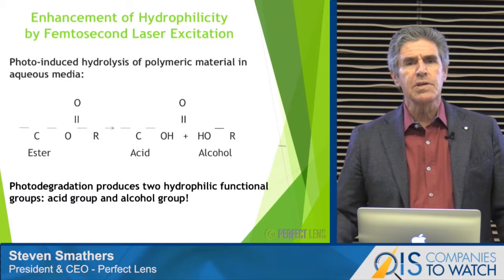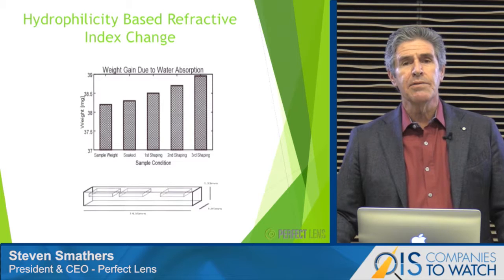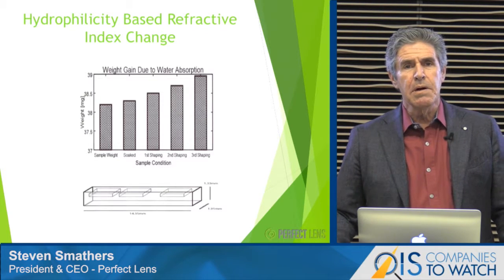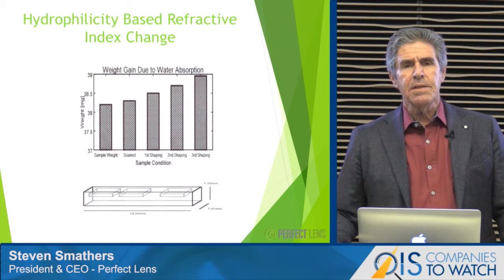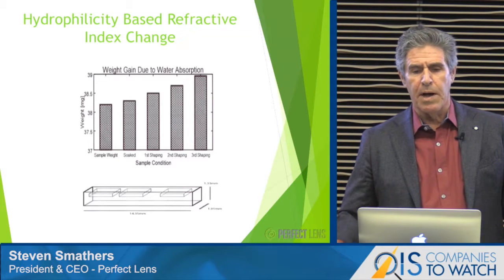In this slide, we show evidence of the results of the change in hydrophilicity. We take a block of acrylic material and treat it. After each treatment, you can see that the block gained weight due to the absorption of additional water.